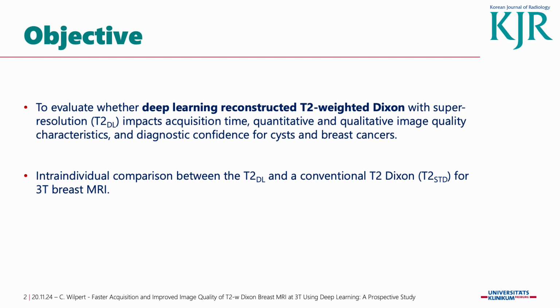The objective was to evaluate whether deep learning reconstructed T2-weighted Dixon sequences with super resolution impact acquisition time, quantitative and qualitative image quality characteristics, and diagnostic confidence for cysts and breast cancers in an intra-individual comparison between those two sequences for 3T breast MRI.